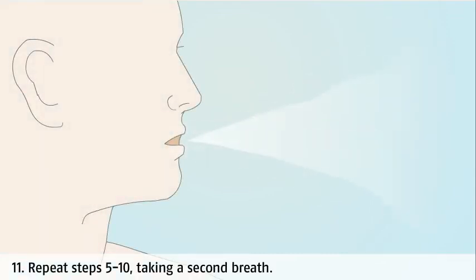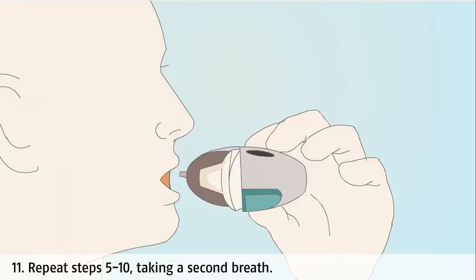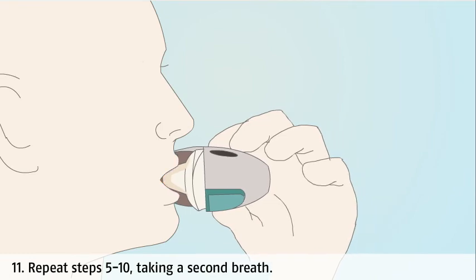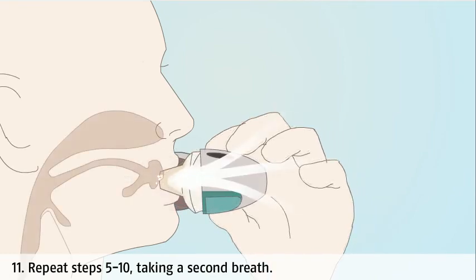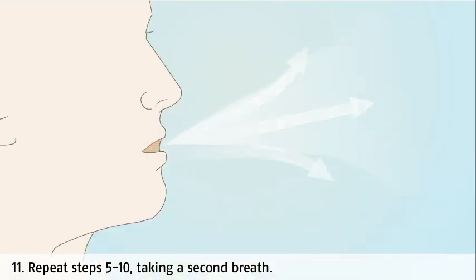Now take a second breath in from the inhaler, remembering to keep your head upright and lift your chin slightly. Place the mouthpiece between your teeth and close your lips around it. Hold your breath for as long as is comfortable — aim for about 10 seconds — and then breathe out normally away from the inhaler. The second breath in is to ensure that all of the powder is removed from the capsule.